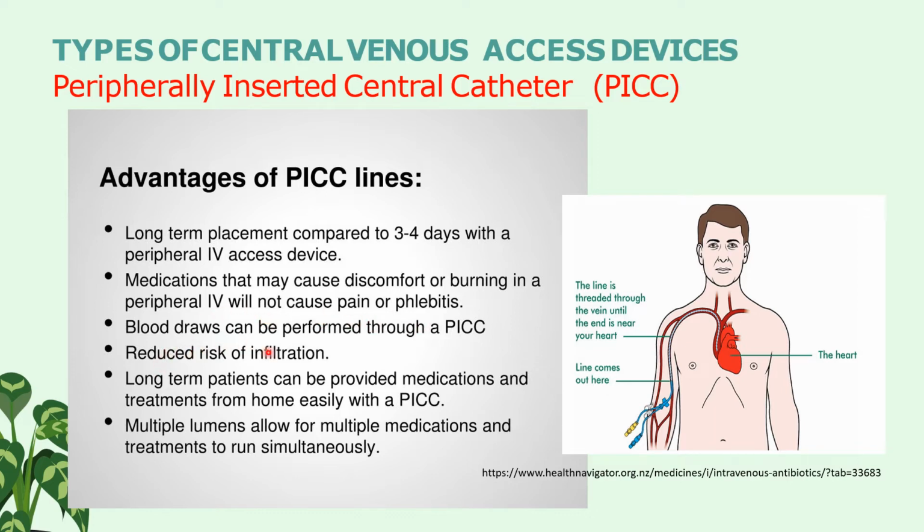Blood draws can be performed through a PICC line. This will also reduce the risk of infiltration. Long-term patients can be provided medications and treatments from home easily with a PICC. The multiple lumens allow for multiple medications and treatments to run simultaneously into the body.